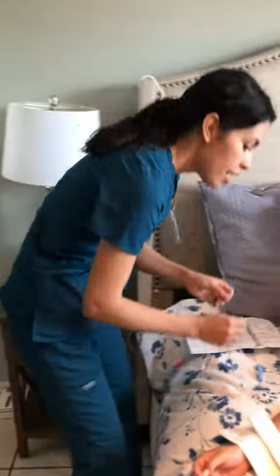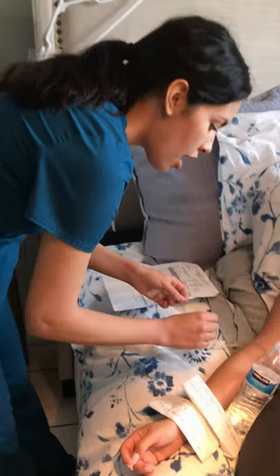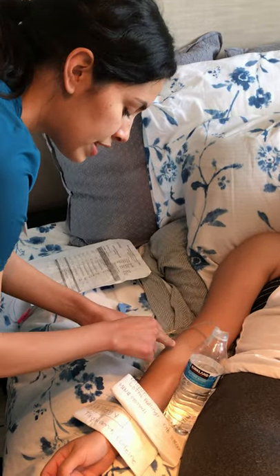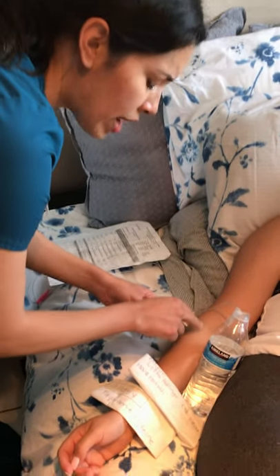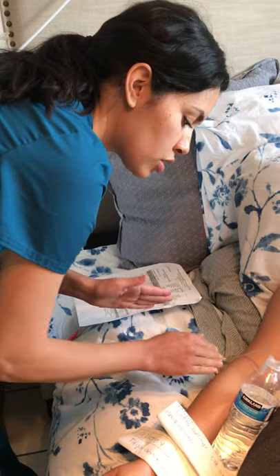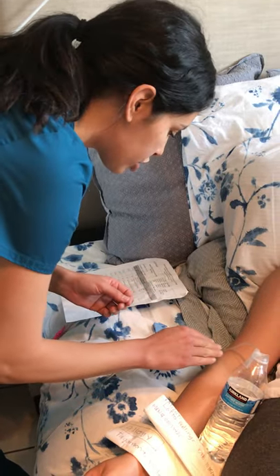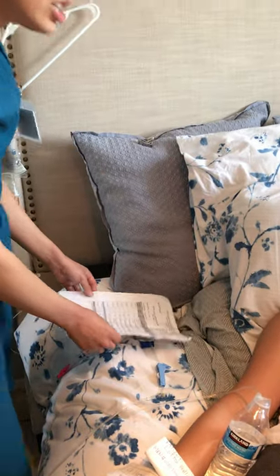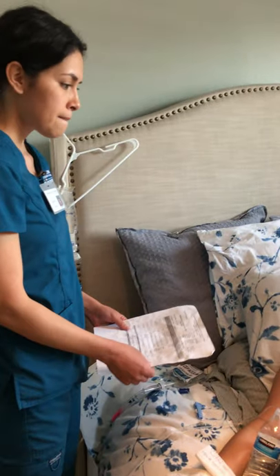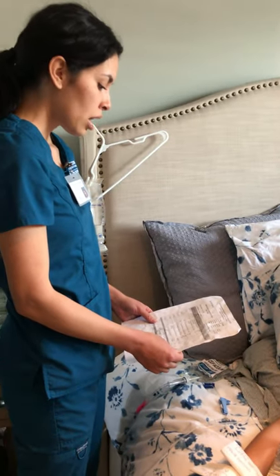I'm going to wash my hands and place gloves, and I'm going to assess your IV site. I would assess her IV site for any redness, swelling, infiltration, or signs of infection — and it looks okay, none of those are present. Ms. Fallings, do you have any pain at your IV site? No.